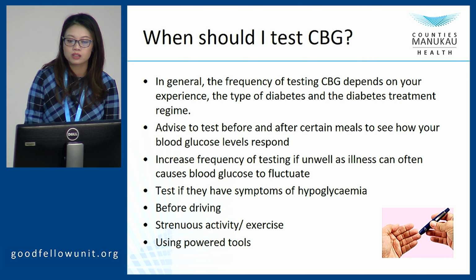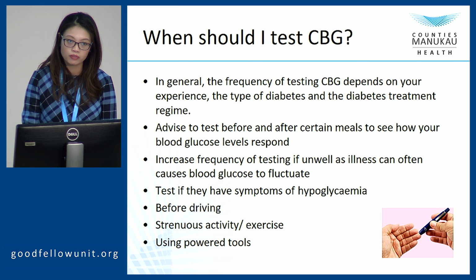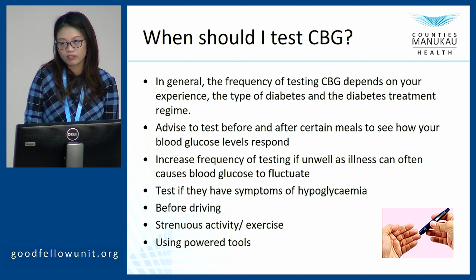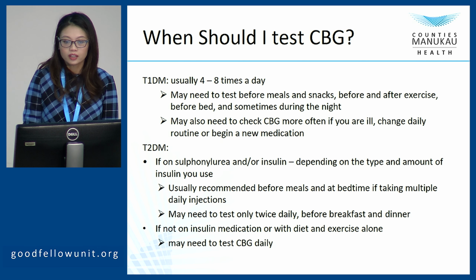We might suggest increasing the frequency when they're feeling unwell or having any symptoms of hypoglycemia, especially before driving for type 1 diabetes, before and after exercise, and also when they change the tire.